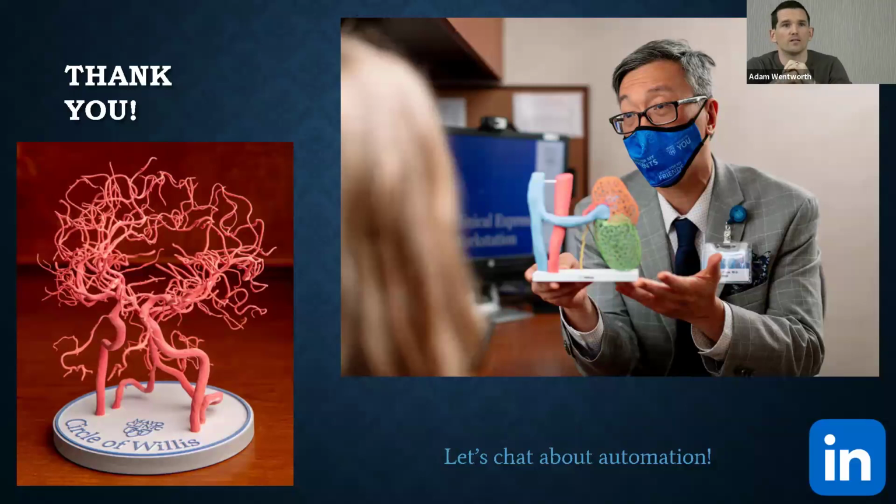Yeah, so all these parts that you see on the screen that are multicolor are exported as OBJ files. That's a single file, and all the parts are embedded within that, and those assigned colors go with it. So yes, it does go to any multicolor 3D printing as an OBJ file. We'll have those colors baked in.